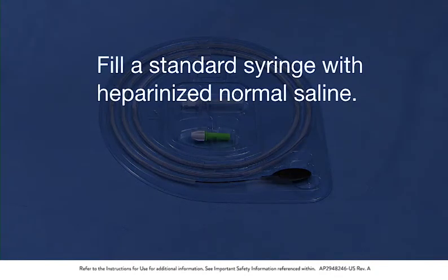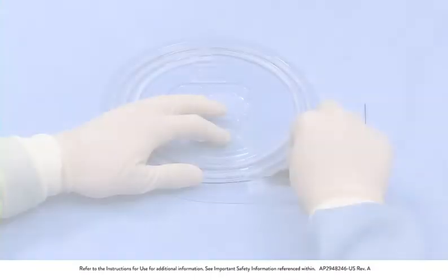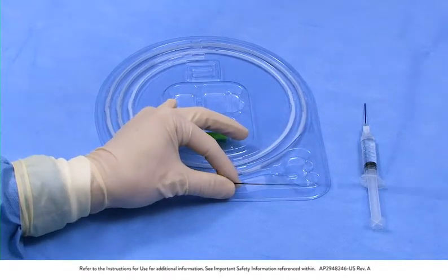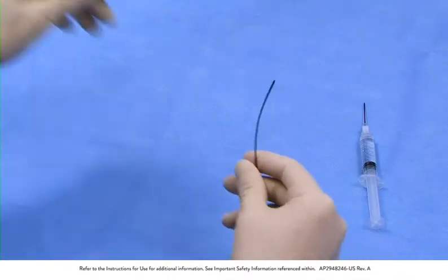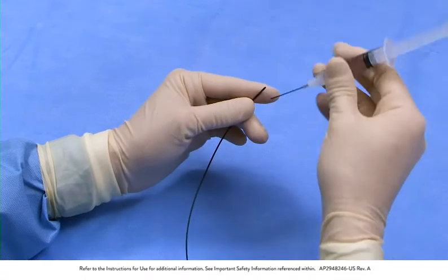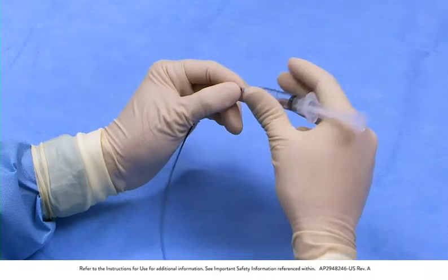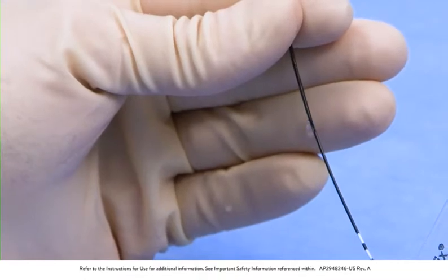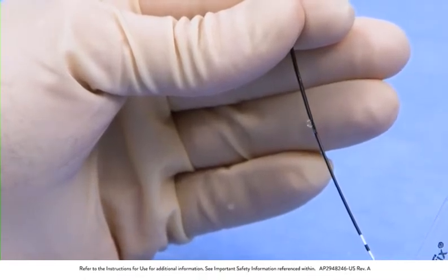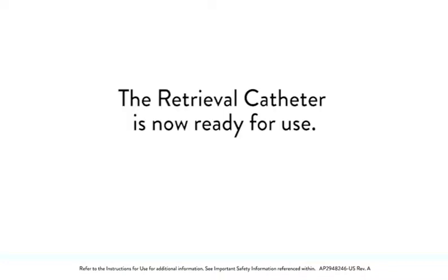Fill a standard syringe with heparinized normal saline. Remove the black syringe flushing tip from the tray and connect it to the syringe. Remove the retrieval catheter from the tray. Insert the black syringe flushing tip into the distal tip of the retrieval catheter. Flush the catheter lumen until heparinized normal saline can be seen exiting at the rapid exchange exit port. The retrieval catheter is now ready for use.